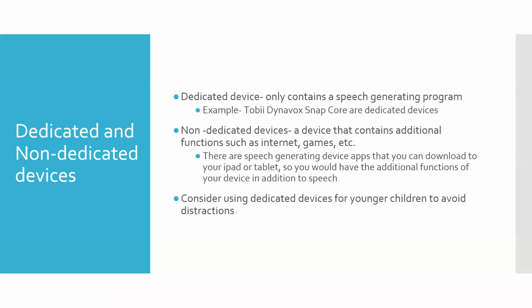So now we're going to talk more about the specific kinds of speech-generating devices and their different features. First, we have dedicated versus non-dedicated. Dedicated devices only contain a speech-generating program. For example, the Tobii Dynavox Snap Core is a dedicated device that only contains a speech-generating program.